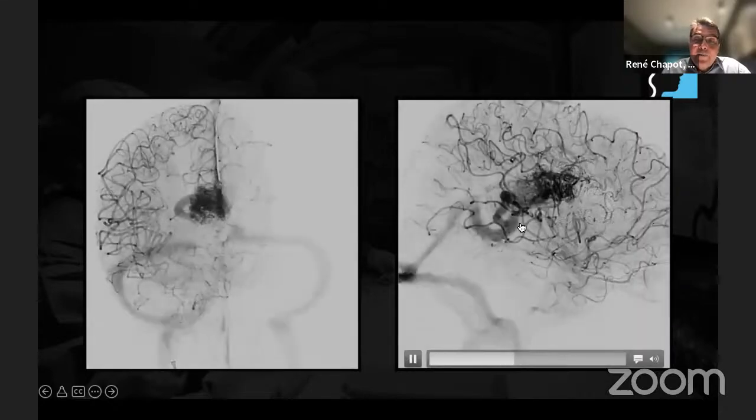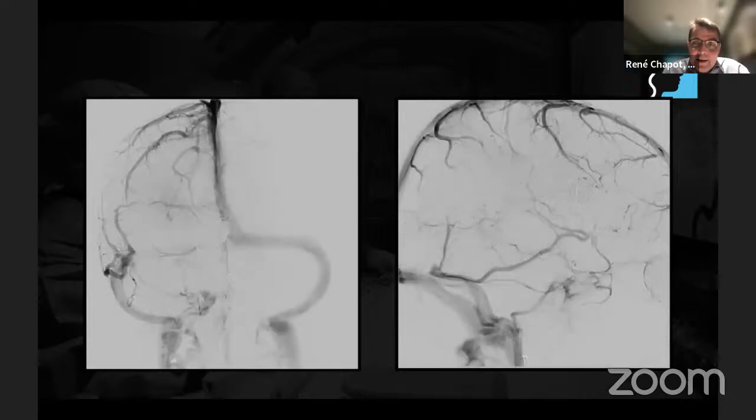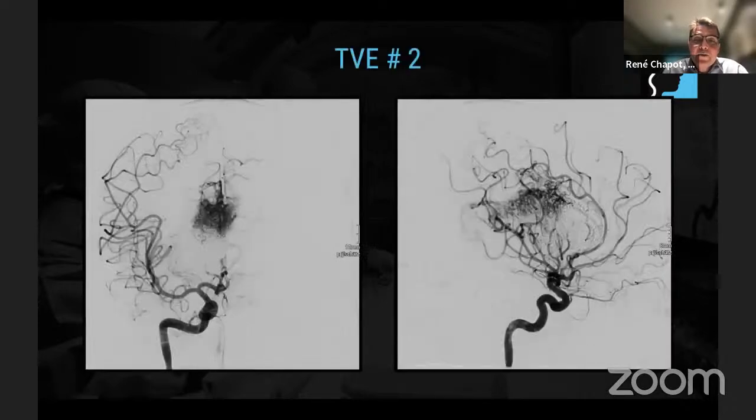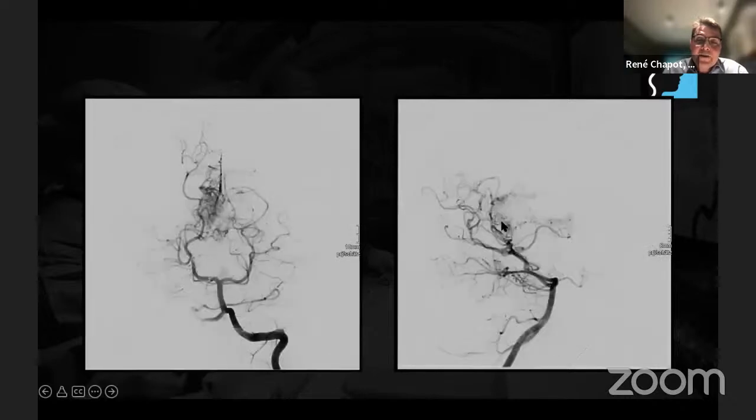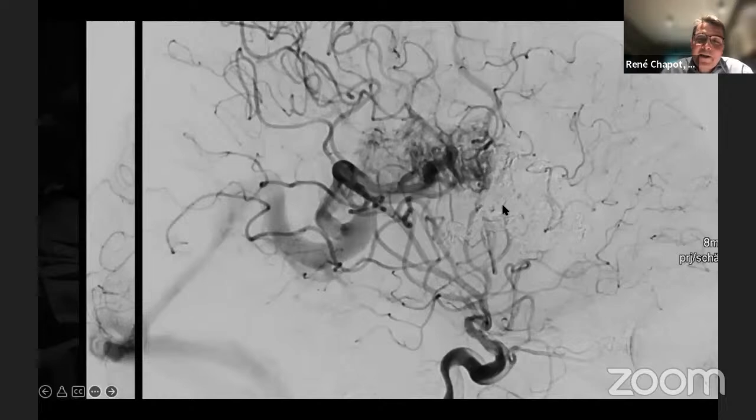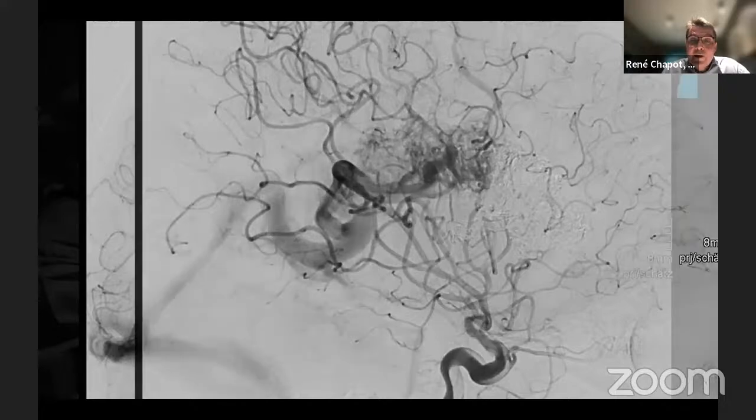And this is for a further step, where I wondered whether this could be done within a single procedure. But when looking more into the details here, anterior circulation, here posterior, it's not that small. So the challenge while going transvenous is, are we going to be able to occlude all shunts if the vein is being occluded? And if we fail, the AVM may bleed. So we must be pretty sure that we'll be able to occlude all shunts. And that's why the fewer shunts there are, the more likely we are to achieve our results.